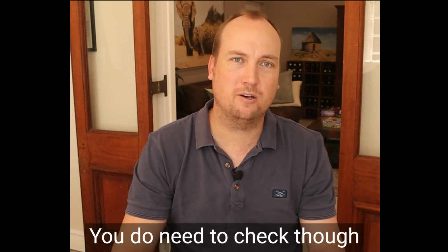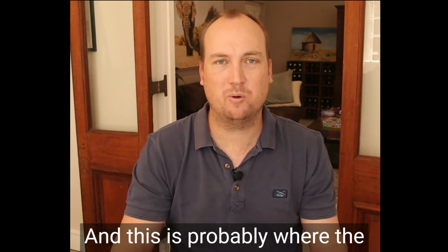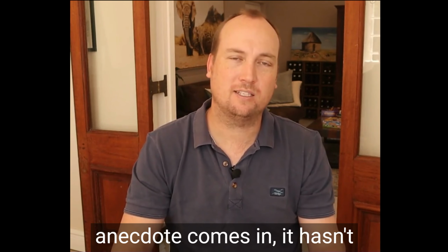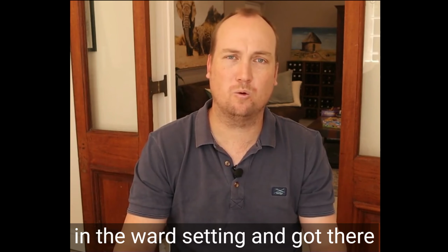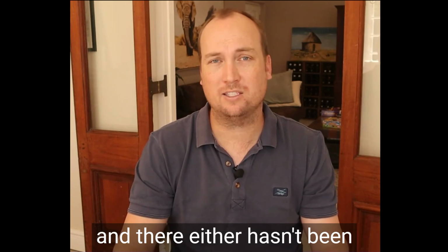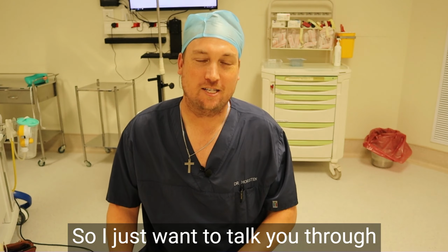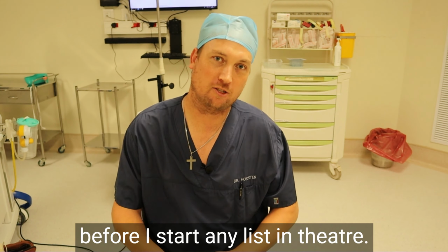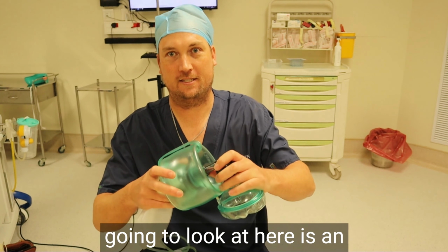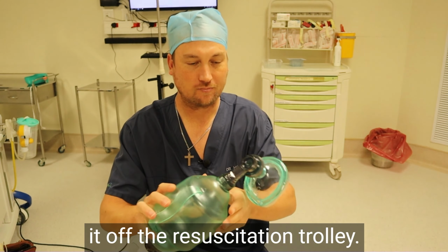You do need to check, though, that the ambu bag is working, and this is probably where the anecdote comes in. It hasn't happened to me in theatre, but I've been called to resuscitations in the ward setting and got there, and there either hasn't been an ambu bag or the ambu bag has been non-functional. So I just want to talk you through how I check the ambu bag before I start any list in theatre. So the first ambu bag we're going to look at here is an adult ambu bag. I've just taken it off the resuscitation trolley.